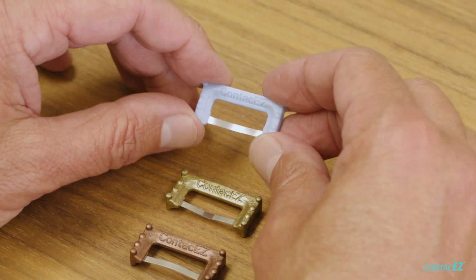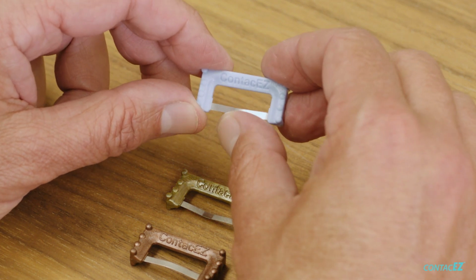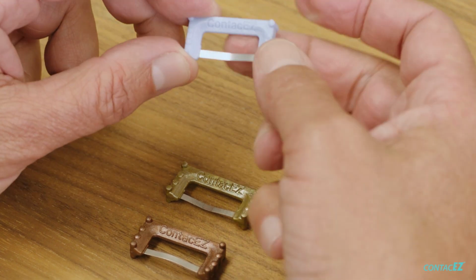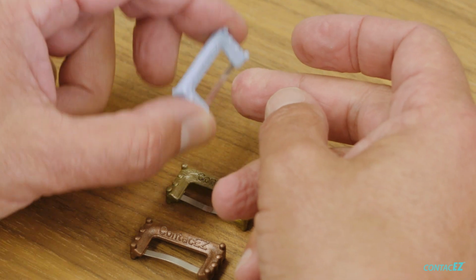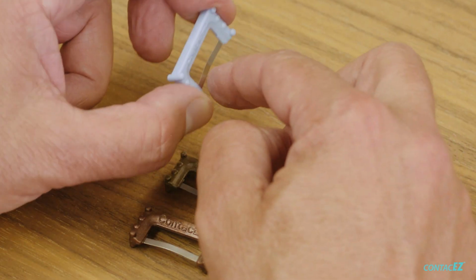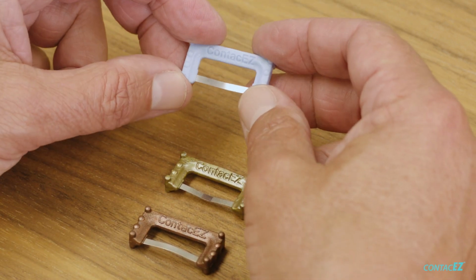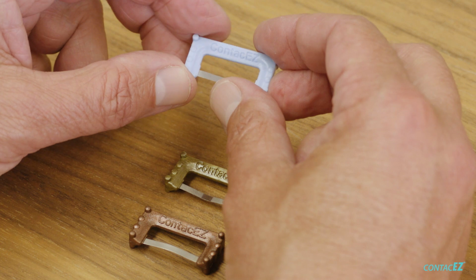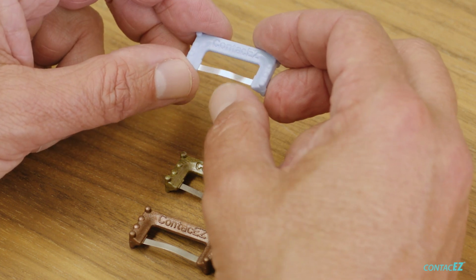But for big overhangs, we're using this blue narrow strip, and this is double serrated. So it's serrated here, and it's also serrated on the top, so you can get under a restoration and pull up while you're sawing through and saw up in that direction, or you can saw down or do both as well. So it cuts on the way up or the way down. And this is for cutting off excess, if you have excess composite, excess amalgam, something like that.